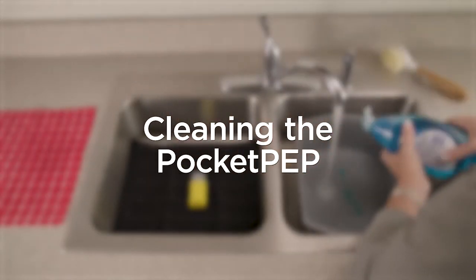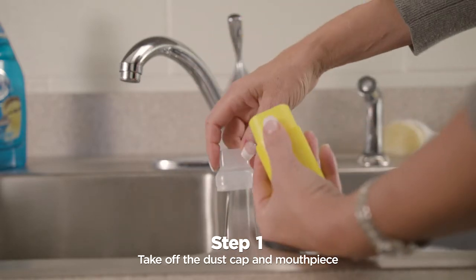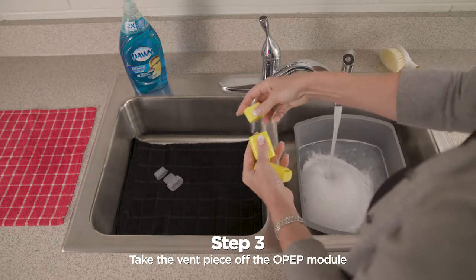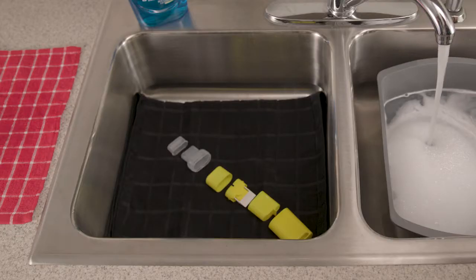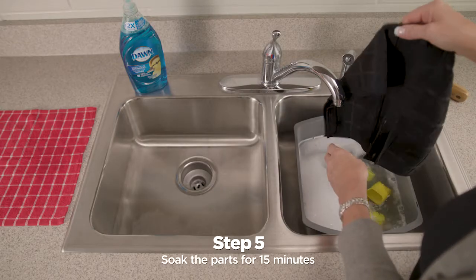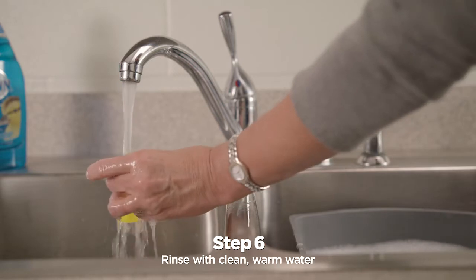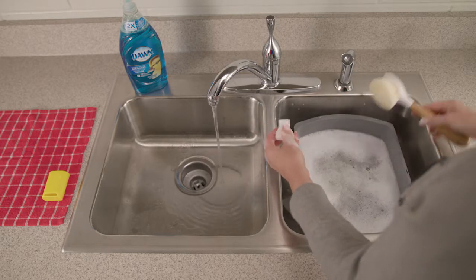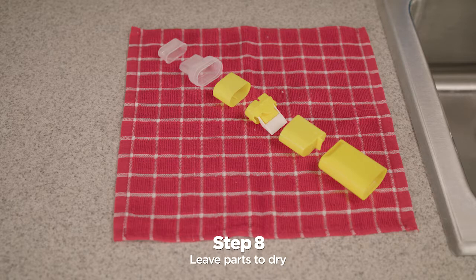You can clean the pocket PEP in warm, soapy water — you can use liquid detergent such as Dawn. Take off the dust cap and mouthpiece. Take the OPEP module out of the pocket PEP case. Take the vent piece off the OPEP module, and pull the flapper valve out of the module base. Make sure that you have all six parts. Wash the parts by soaking them for 15 minutes, moving them around from time to time, then rinse with clean warm water. If they are still not clean, wash them again — you can use a soft, lint-free cloth or a soft bristle brush to help clean them. Shake off any water from each part and leave the parts to dry. Make sure that there is no soap or water left in them before you put them back together.